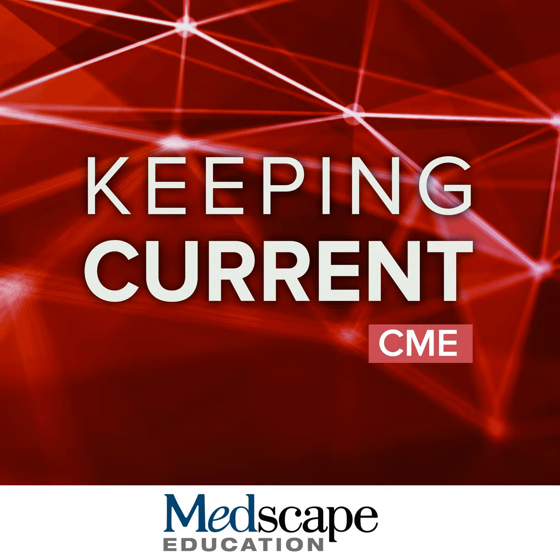What about non-medical use? So medical legal, establishing competency or something. That is not an appropriate use for the amyloid and the tau PET. And then finally, what about should we use these PET scans instead of genetic testing to identify risk? And again, this was also not recommended.